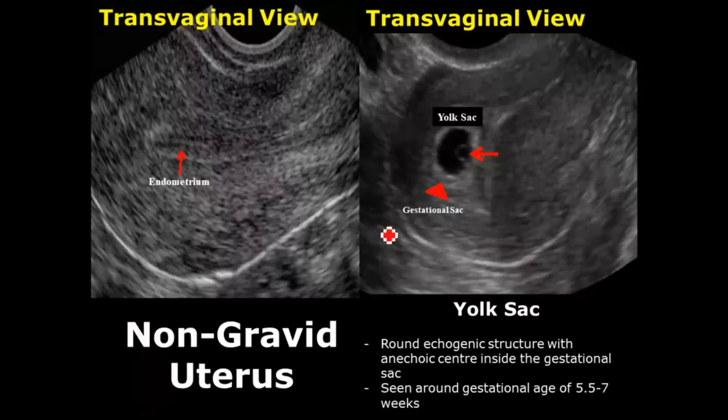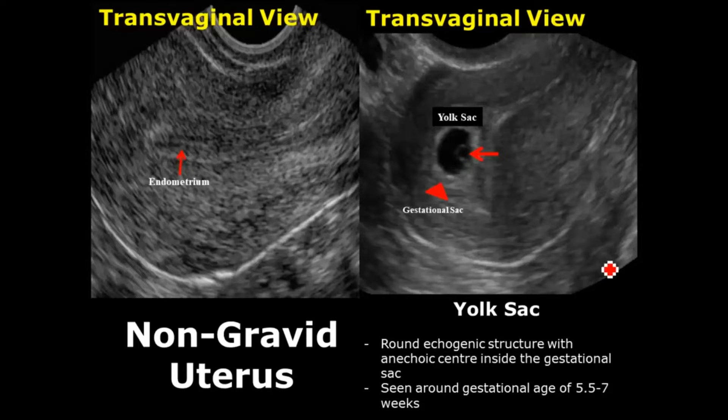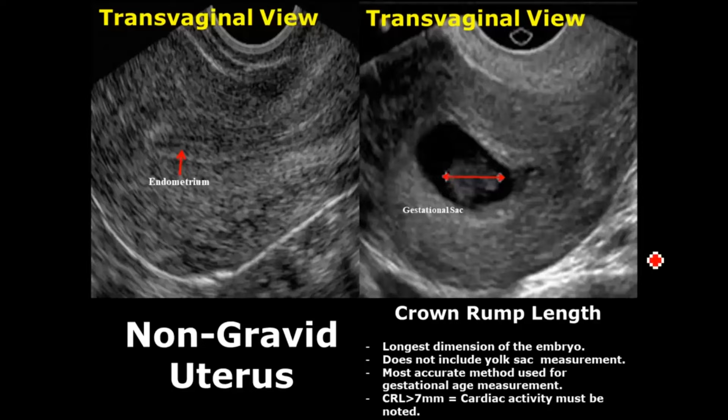The yolk sac is the first structure visualized in the gestational sac. It is an echogenic structure with an anechoic center and is usually seen around the gestational age of 5.5 to 7 weeks. The crown-rump length is the longest dimension of the embryo and is the most accurate method used for measuring gestational age. It is measured by placing one caliper on the head of the embryo and the other caliper on the end of the body.